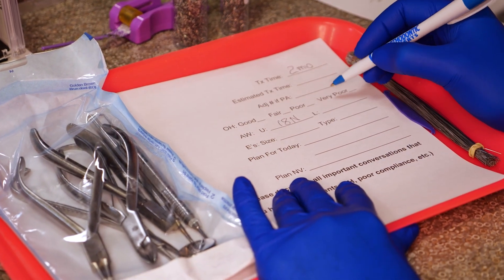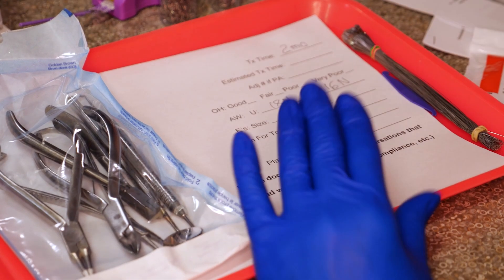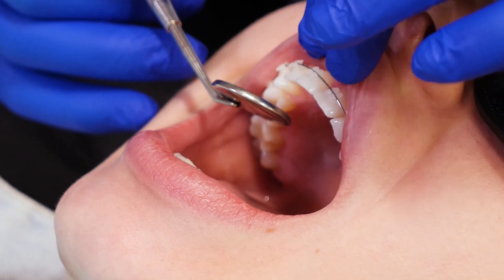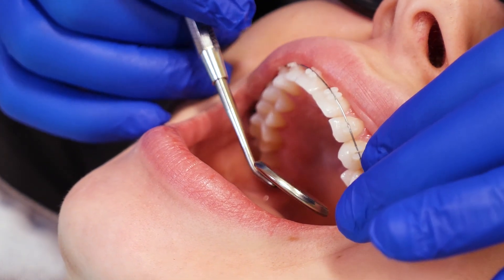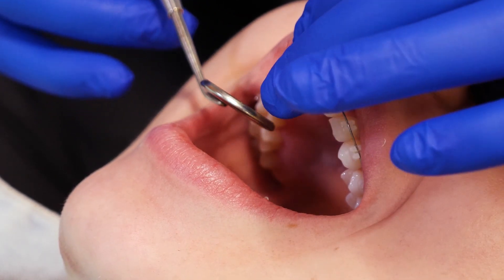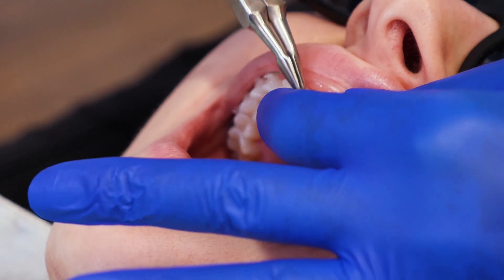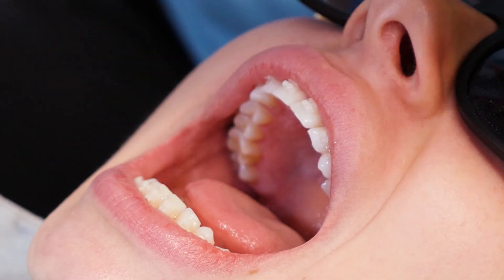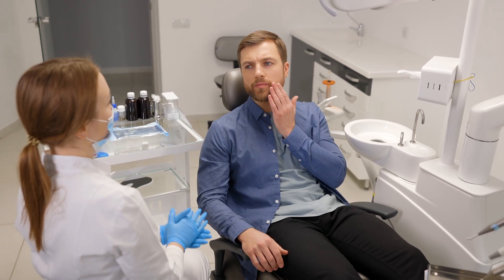In some cases, your wire will not be changed at your adjustment appointment. In fact, it's not unusual for your wire to remain the same — this is nothing to worry about and won't necessarily affect your treatment plan. If enough movement has been made, they may increase your wire size. If not, they may keep the same wire size. In rare cases, they may decrease wire size to reduce the pressure and relieve discomfort. Adjusting to new braces wire sizes can cause temporary discomfort, especially after each adjustment. However, rest assured that any discomfort is temporary and typically subsides within a few days.